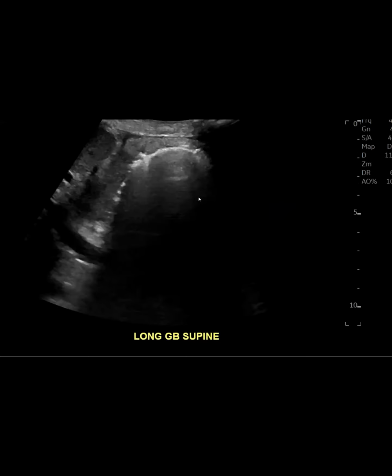So you called it comet-tailing. I would call this echogenic stuff with dirty shadowing, concerning for emphysematous cholecystitis, like you said, pneumatosis or air in the gallbladder. So this is a nice example of dirty shadowing, not the clean shadowing you would see if there's calcification. So then if you see that, have a low threshold.